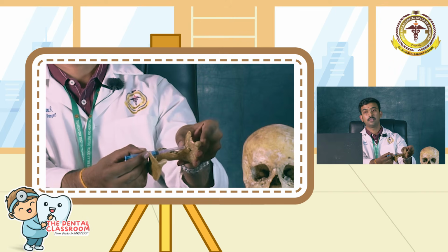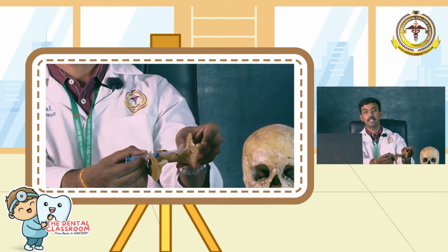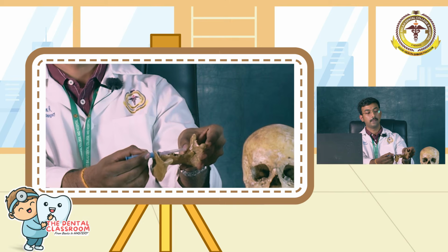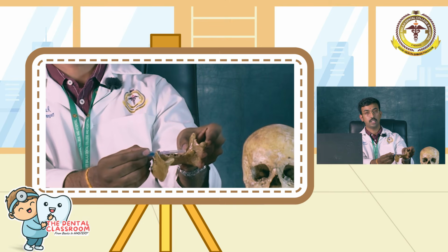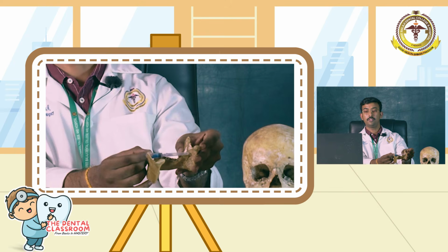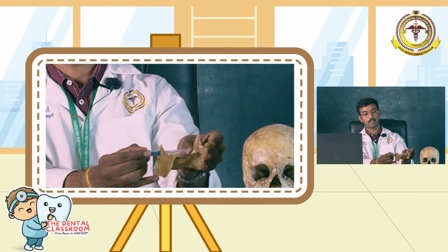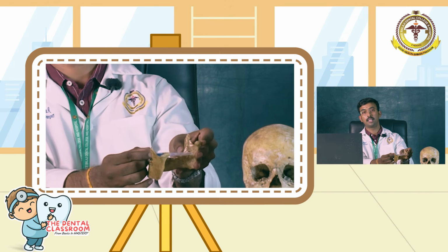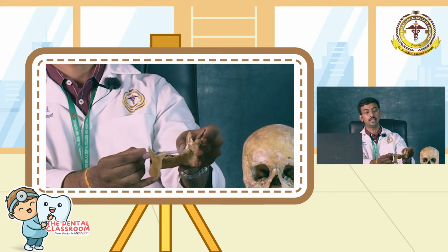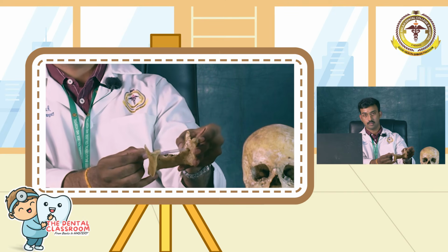In such cases, what we have to do is slightly withdraw the needle without completely removing it from the mucosa, slightly reorient it posteriorly and redirect it towards the target area. If the bone is not contacted, meaning we are going too far posteriorly, then again we have to readjust by withdrawing it halfway, readjusting it anteriorly and going in to hit the bone.